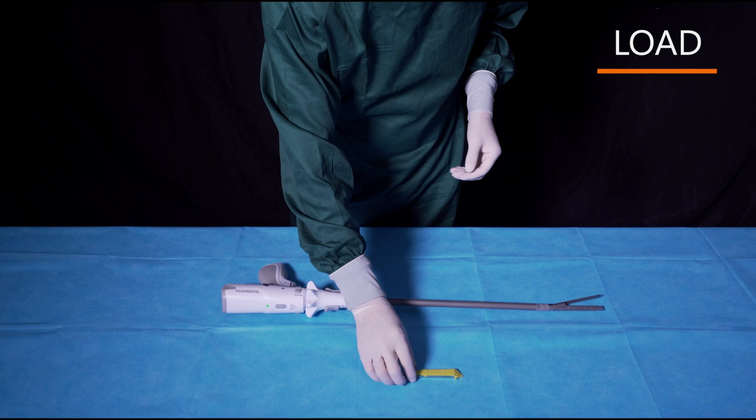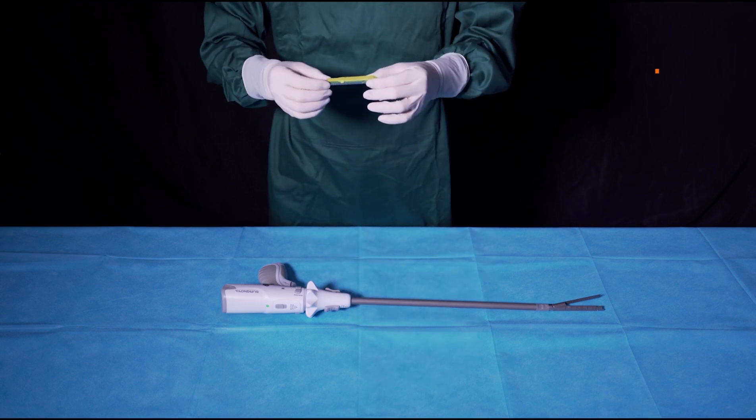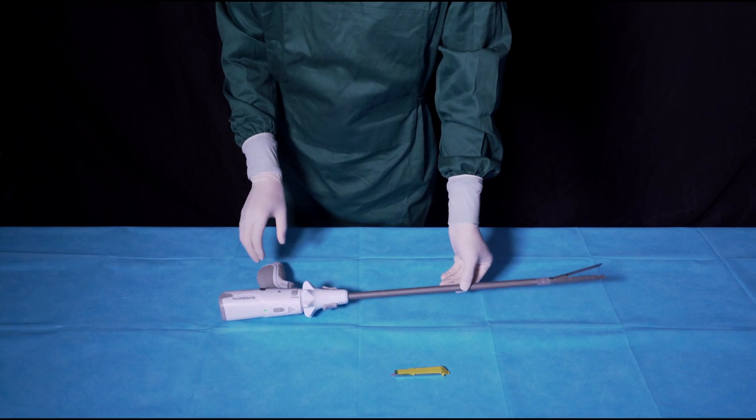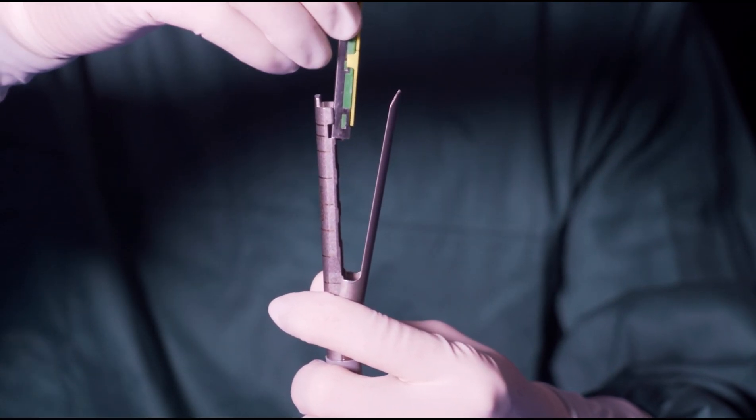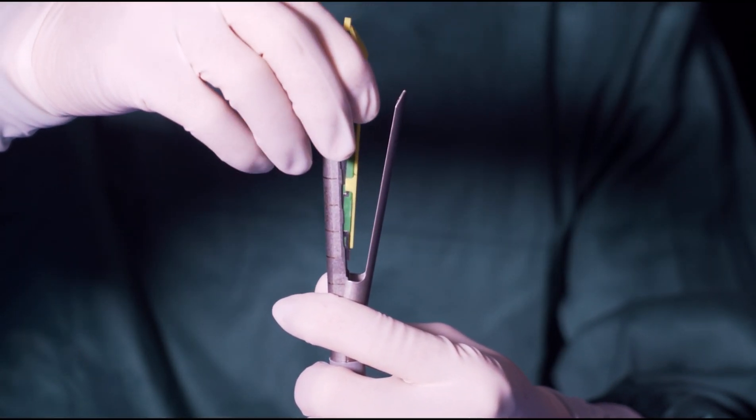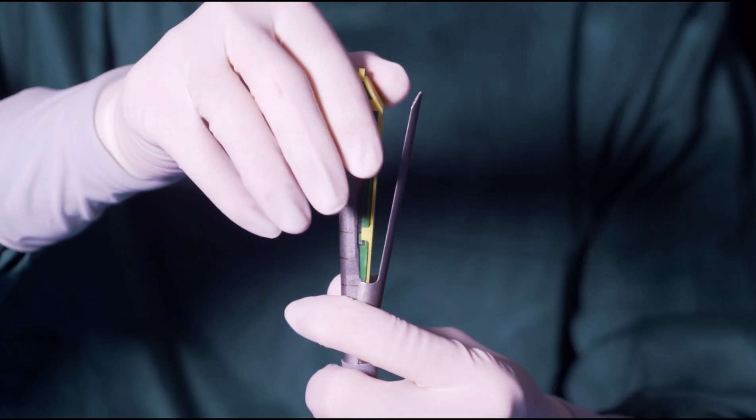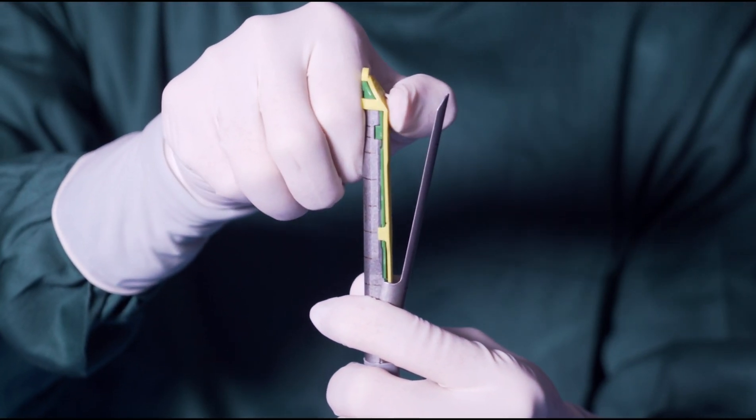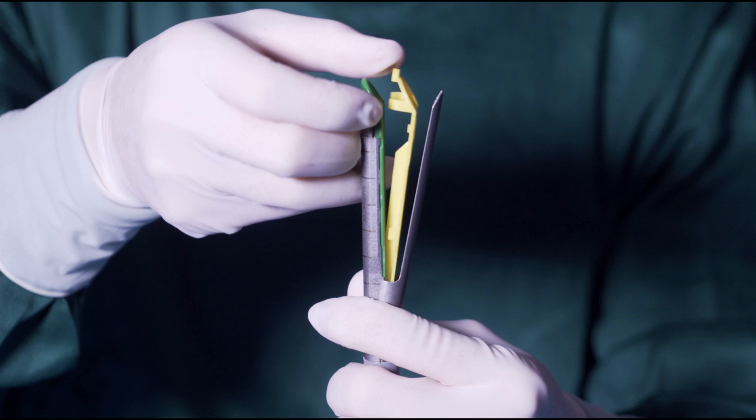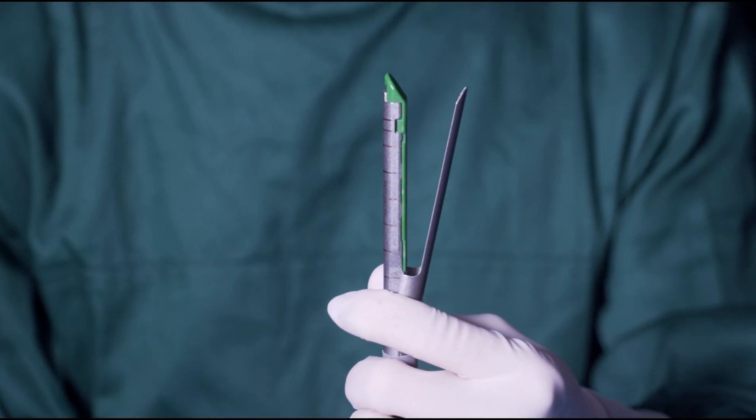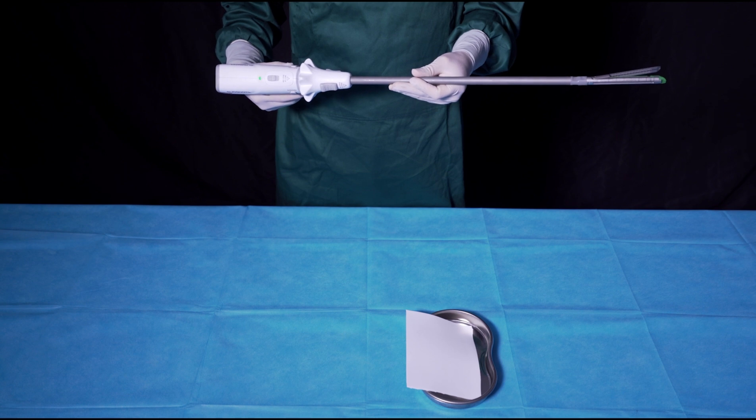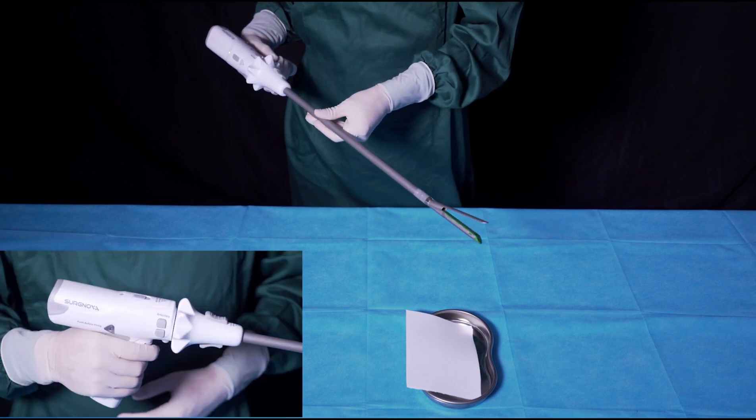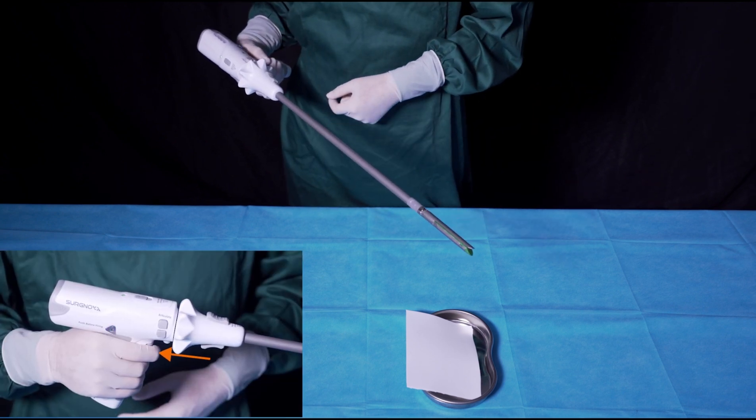Ensure that the staple, retaining cap, and sled are intact. Make sure that the jaws are open. Slide the reload into the bottom of the reload cartridge from the middle unit. The reload alignment tab is locked in the slot. Then remove the protective cap after hearing a click sound. After confirming that the reload is positioned correctly, long press the close button to close the jaws.